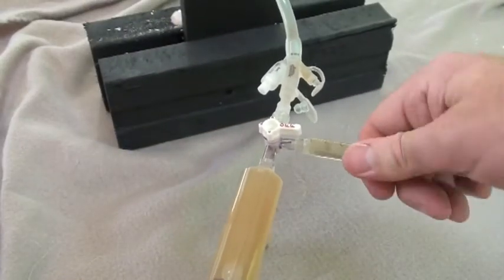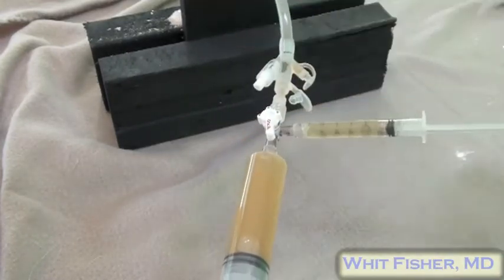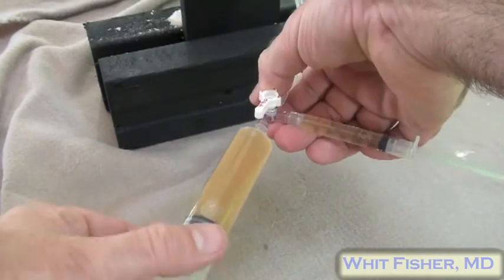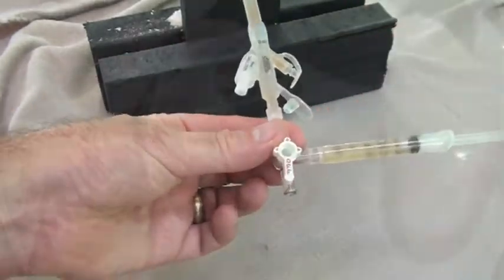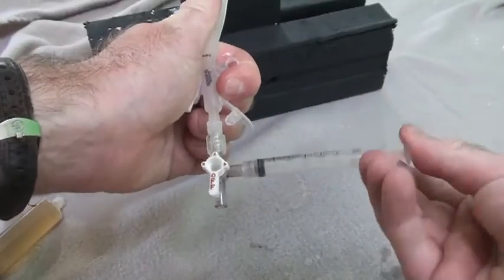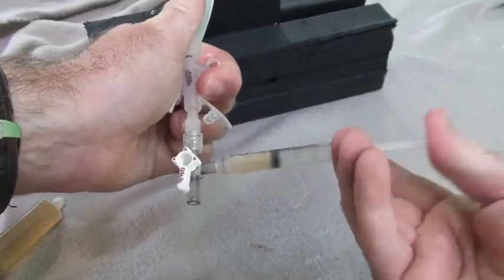Then you take a small syringe, like a 3cc syringe, and this is important, filled with liquid, not air, and attach it to the other port on the three-way stopcock and plunge it back and forth. This creates much higher pressures, which sometimes can dislodge a really tough clog.